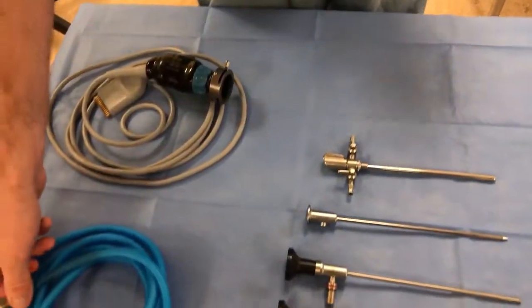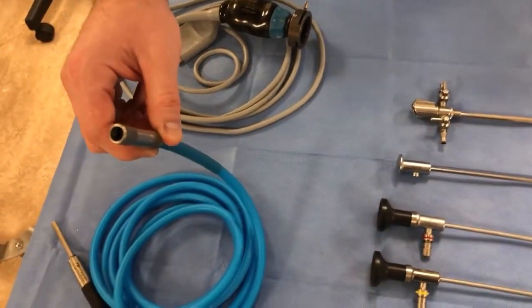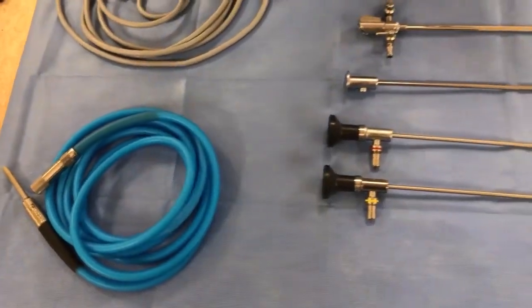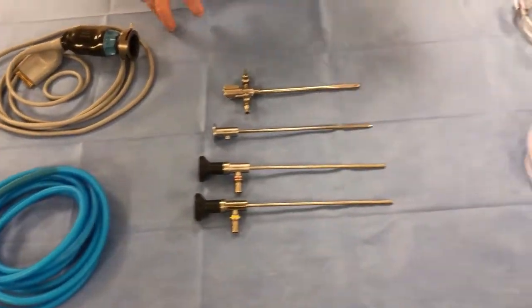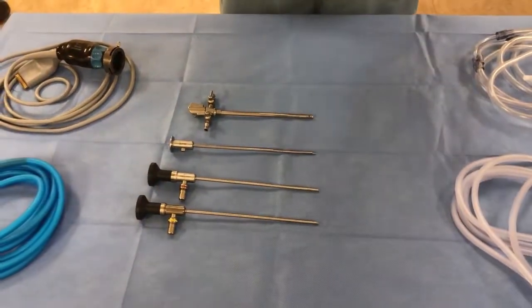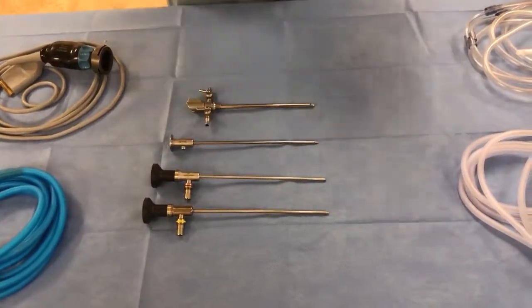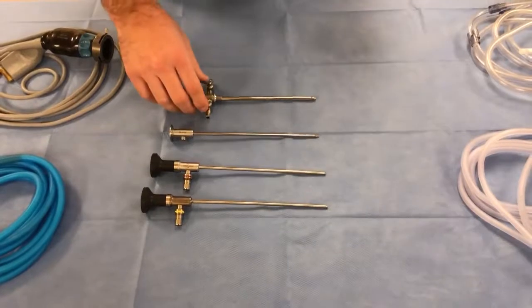The other important component is the light cord, which attaches to the light source and allows you to visualize. I'm going to set up the equipment the way it's typically set up for you on the table so you know how it got to that point.